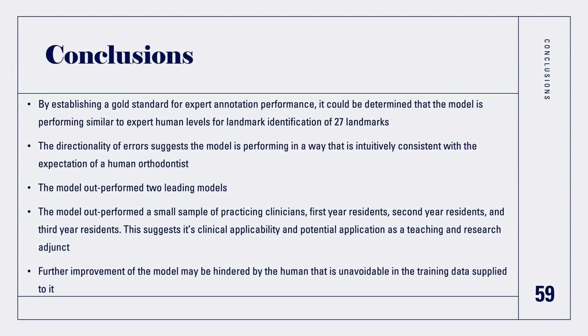The model also outperformed 2 leading models and outperformed a small sample of practicing clinicians, first-year residents, second-year residents, and third-year residents. This suggests its clinical applicability and potential applications as teaching and research adjunct. Further improvement of the model may be hindered by the human error, though, that is unavoidable in the training data supplied to it.